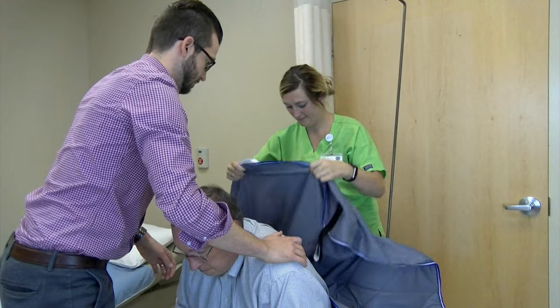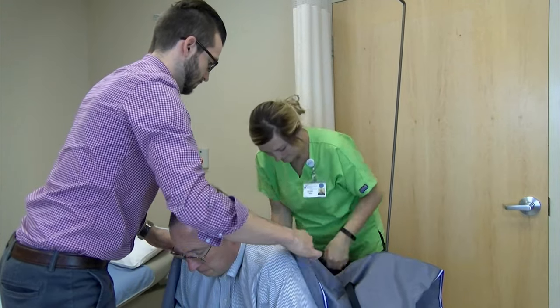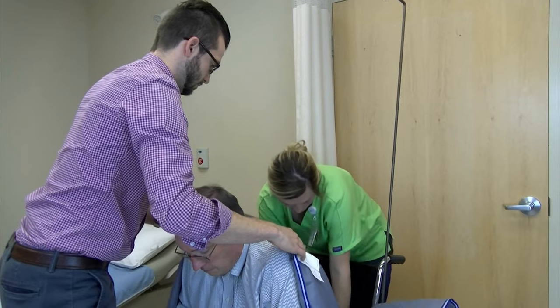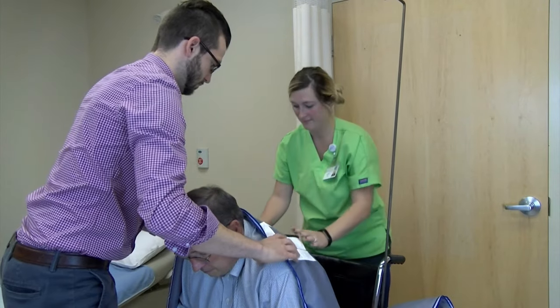Place the sling behind the patient with the smooth surface against the patient and the handles on the outside, making sure to place the opening close to their bottom. Then lean the patient back in the chair.